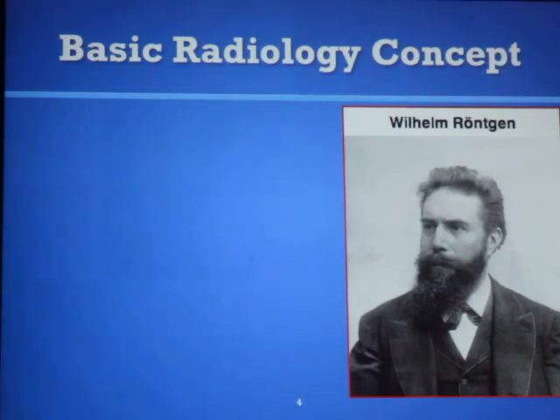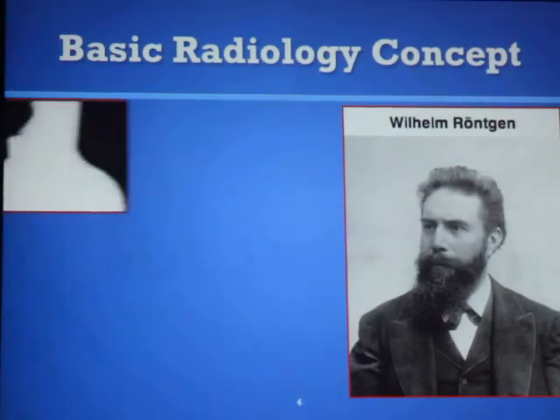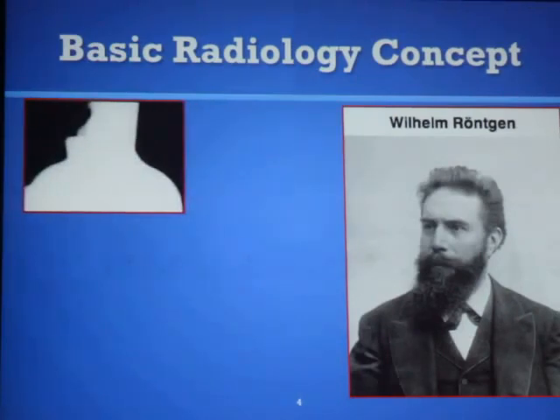So since then, in last 120 years, we have made lots of advances in radiology, but the basic concept has remained same. If we look at this screen, and that metallic object was exposed to the X-rays, and this is what we see on the film.